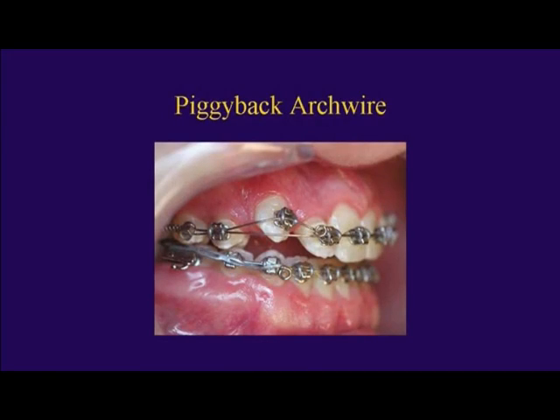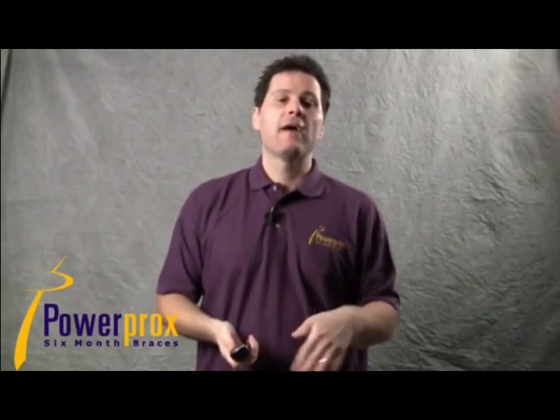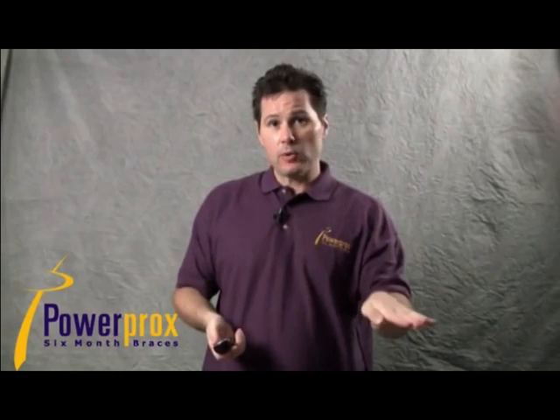And here's a clinical example. You can see we have our main base wire bypassing the canine, and then our second piggyback light nickel titanium, like an 014 is perfect, arch wire going through the premolars, up to that high canine, and then over to at least the central or contralateral central. And that's going to help bring that canine down very quickly.